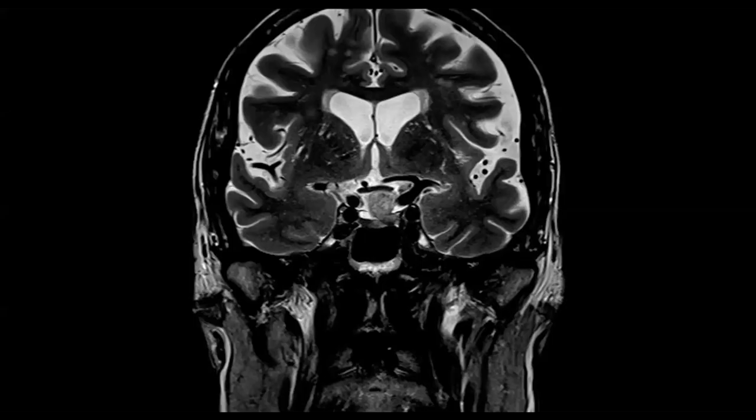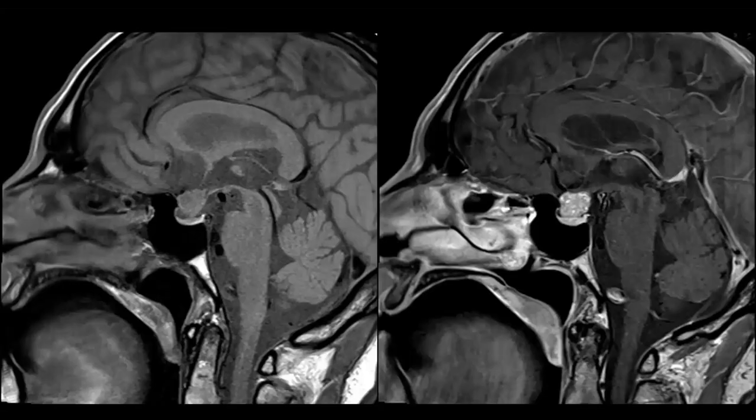Patient 3, 75-year-old male, Octavio. A sellar and suprasellar mass, which I believe does not originate from the pituitary gland. It's extending towards the chiasm and displacing it, but not quite invading it. Perfect. What sequence are we looking at here? T1 pre and post contrast, it demonstrates homogeneous enhancement. And I'm not quite sure where it is arising from, but I would guess it seems to be splaying the third ventricular recesses. It's displacing posteriorly. Okay, good.